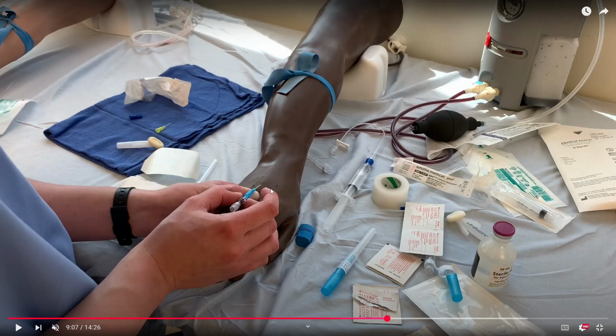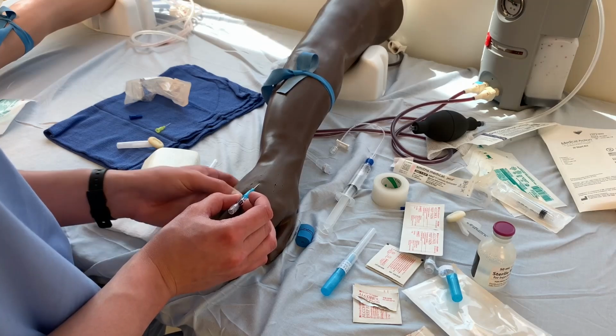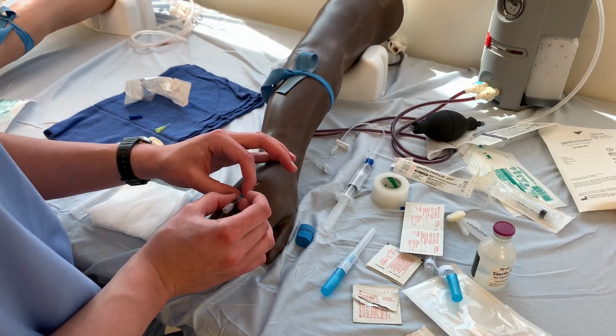However, again, this is rubber. Humans are not rubber. The rubber is going to fight back, so you really have to use two hands to do it. But the textbook way to do it is to take this finger and flick it off, in the sense of flick the blue catheter off. It's not always blue, just talking for the specific example. So you notice I have to use two hands for this.